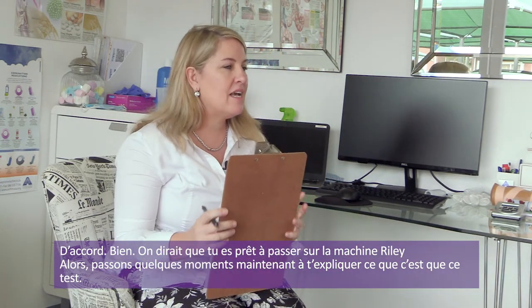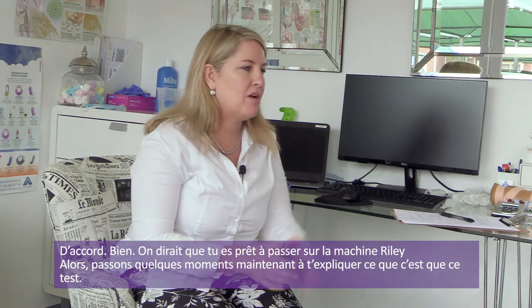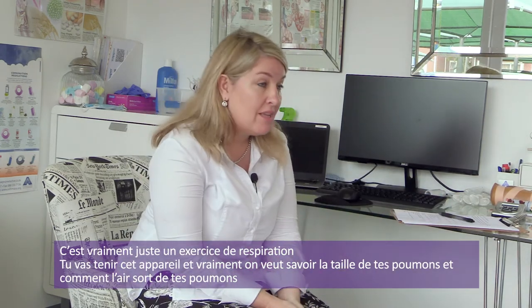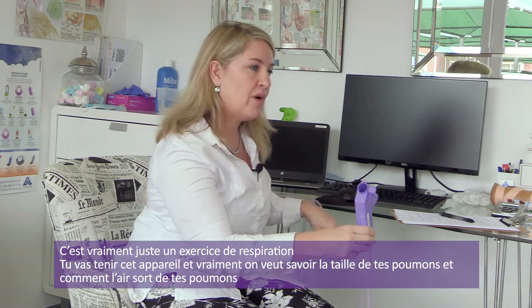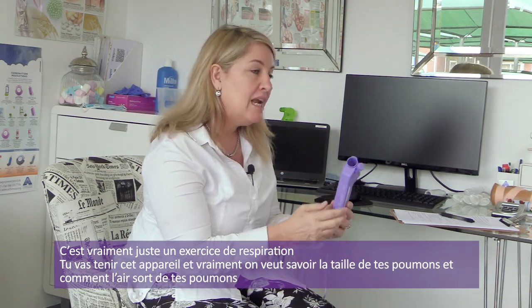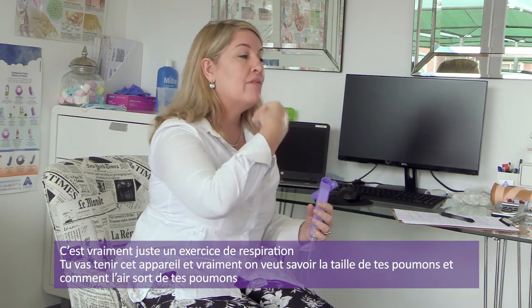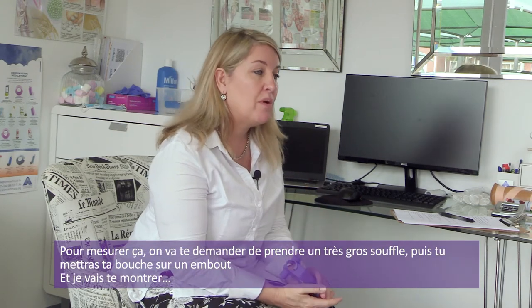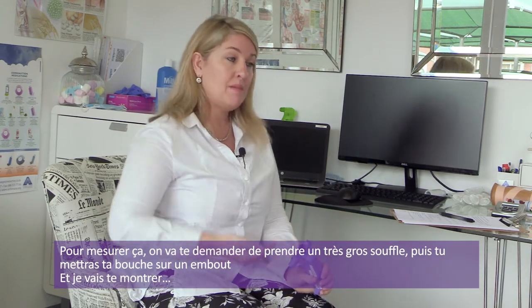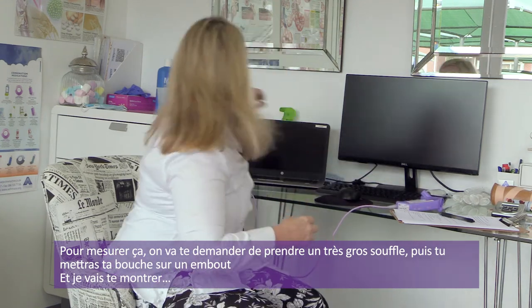So let's just take a few moments now to explain to you what this test is about. So really, this is just a breathing exercise onto this little device. So you're going to hold this device in your hands. And really, it's about measuring how big your lungs are and how the air is flowing out of your lungs. Okay? So to measure that, what we have to do is ask you to take a very deep breath in and then to put your mouth onto a mouthpiece. And I'm going to show you.